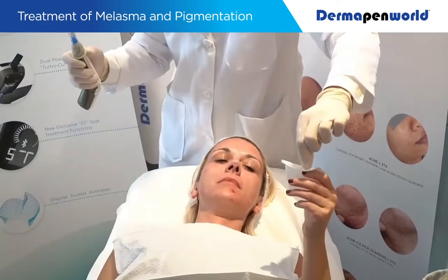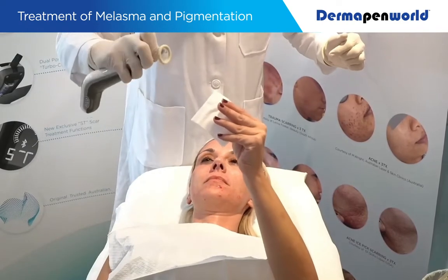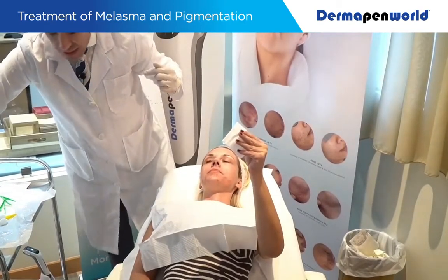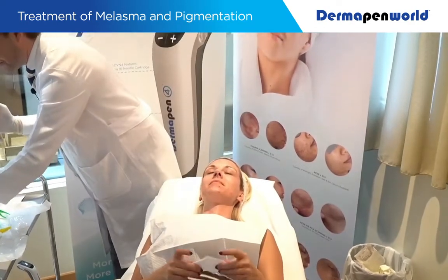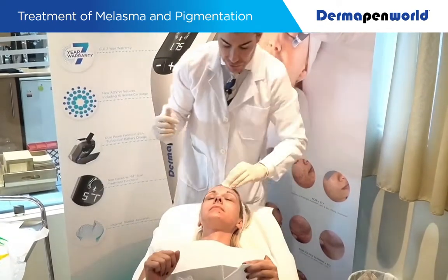Just give me your hand. Perfect. So, and then with one hand, take the needle cartridge out, and then that goes straight into a sharps bin for the patient. Now, at this point, some gauze, some Cliniprep solution, and we want to work quick. So I want to remove any procedural residue.